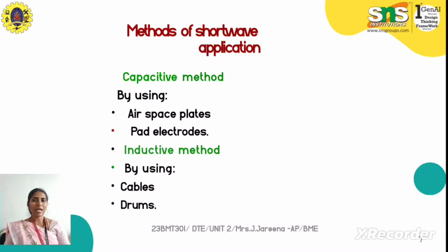Everyone, and now let's have the continuation of last class. So that is shortwave diathermy. So in this class we are going to discuss what are the different methods of shortwave diathermy applications.